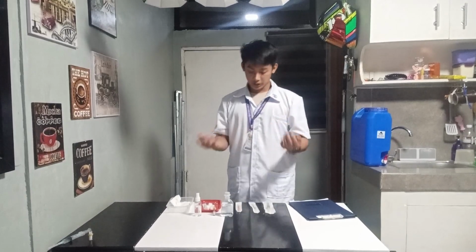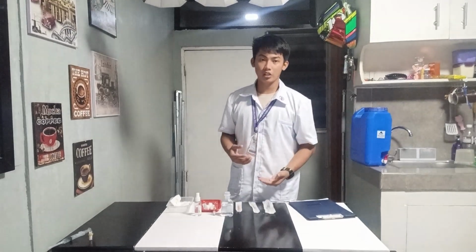Next, we're going to organize the equipment needed to promote time efficiency. To prepare the medication, of course, we need to have the syringes. I have a tuberculin syringe, an insulin syringe, a 5cc syringe, an aspirating needle, a hypodermic tray, and forceps.